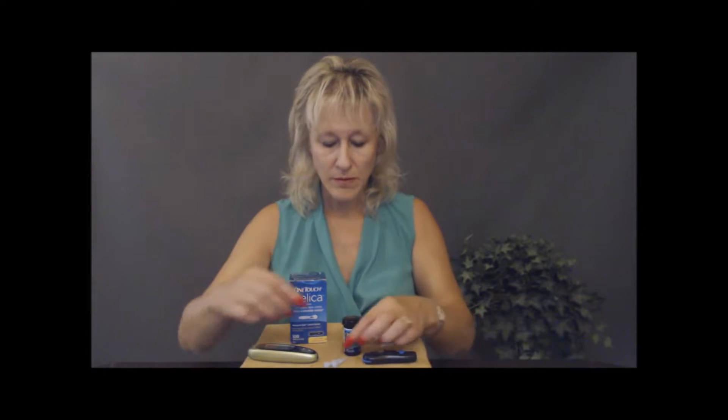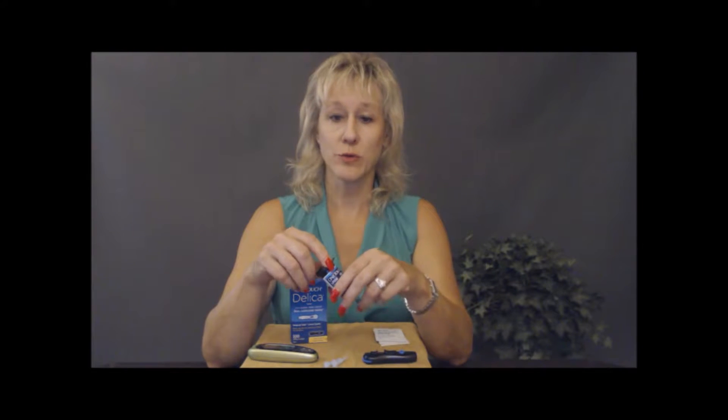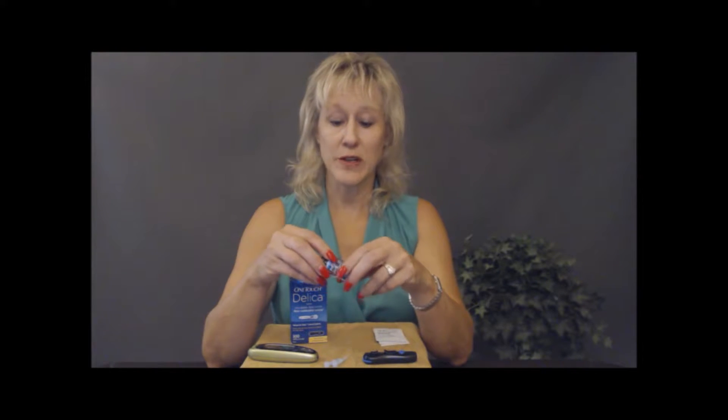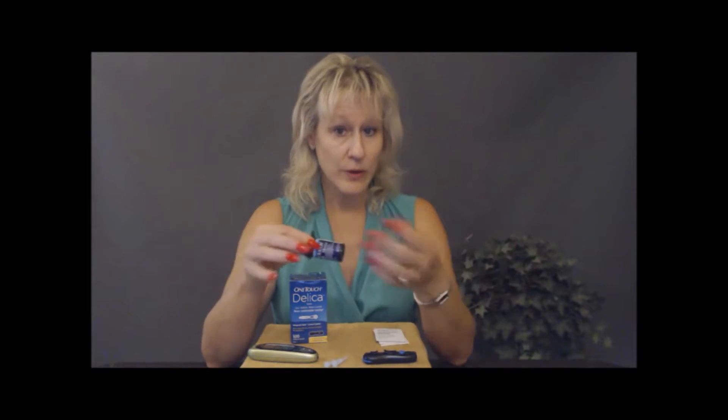Your glucose strips — always check the expiration date. They can wear out, and extreme heat could possibly have some effect on them. So be careful about leaving them in a car, especially if you live in a hot area. Extreme cold is also a concern. Be careful about leaving any of these supplies in your car for a long period of time — we don't want them wasted and not working appropriately.